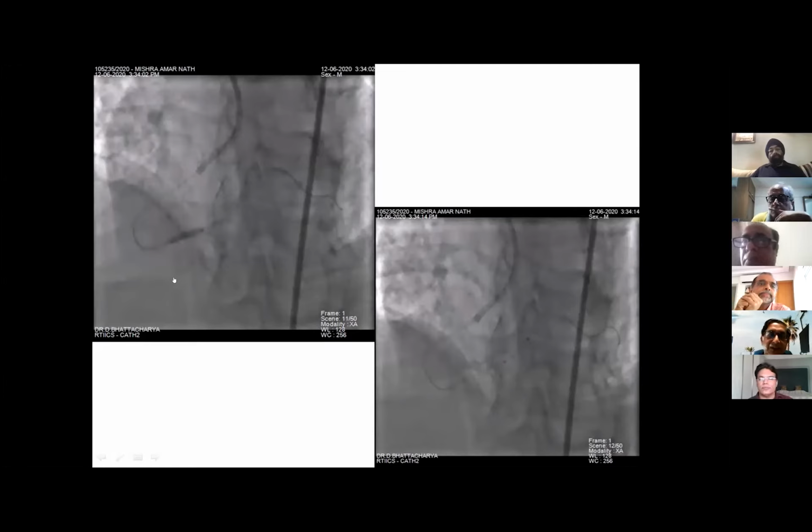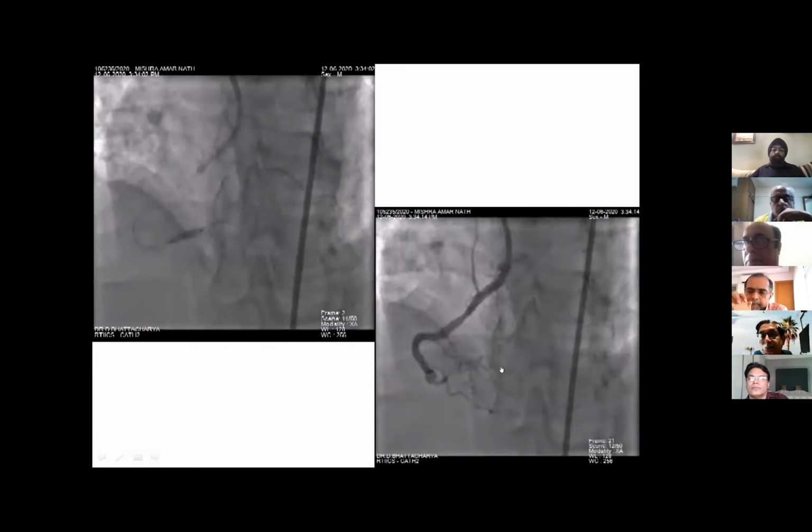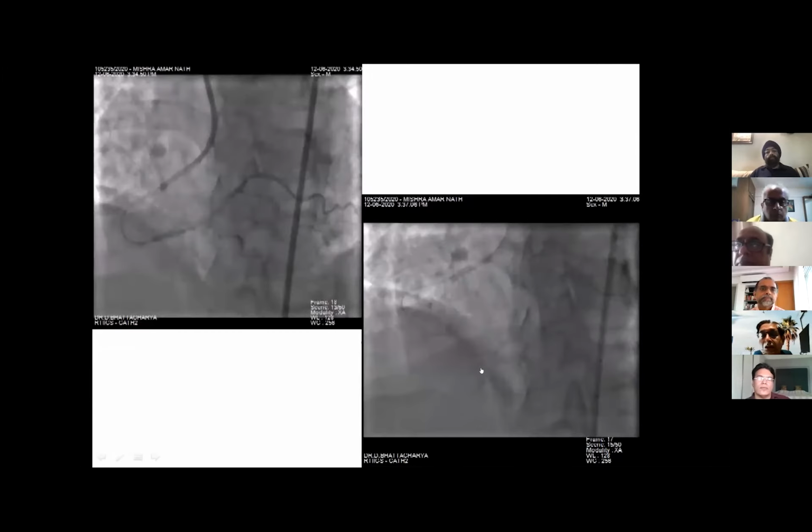So I chose an AL2 guide catheter, and this is a Whisper extra support wire, which I have lodged into the PLB. I did a quick dilatation of the first lesion, and then I went into the PLB and dilated the PLB. And you can see that the PDA looks like a very small, miserable vessel. But I always believe that the PDA grows. So after this we did some further dilatations. And now you can see the PDA growing a little bit, and the PLV angioplasty result is a reasonable result.